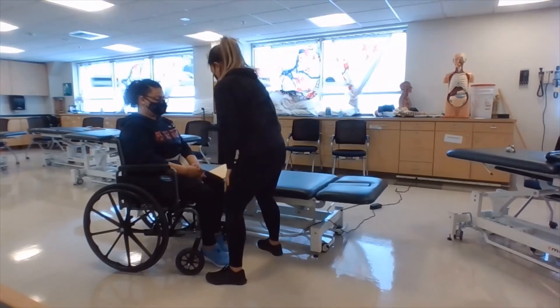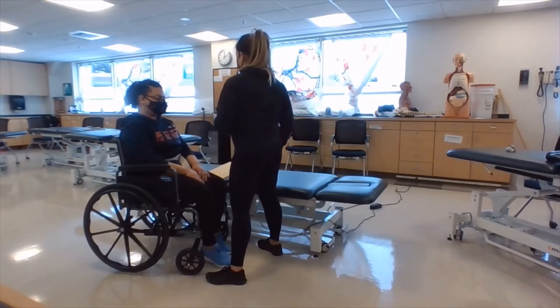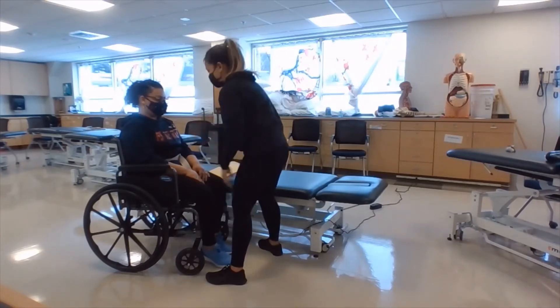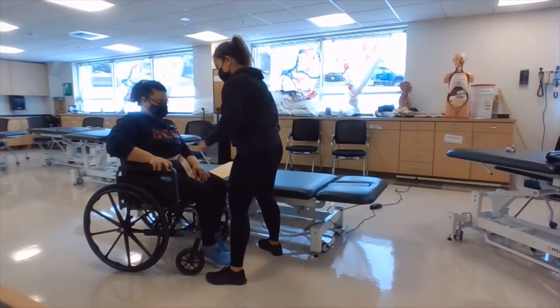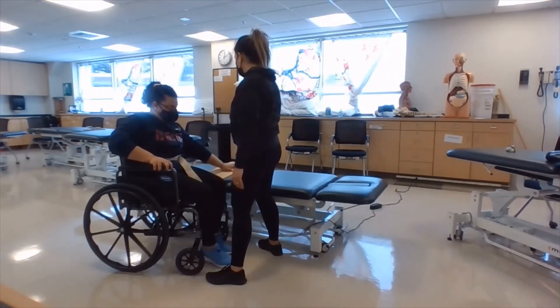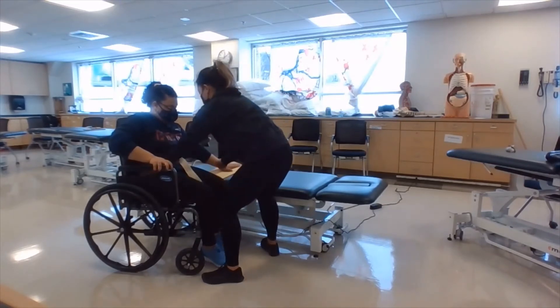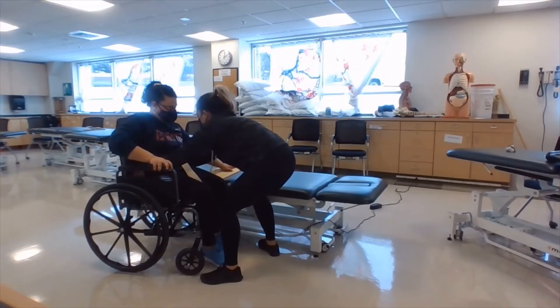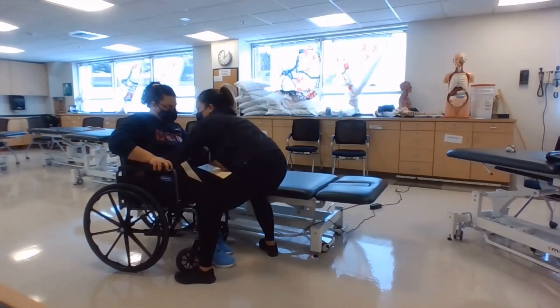The next thing you want to make sure of is having a wide base of support while you do this transfer. I'm going to break it down into two parts. The first part is having the patient rest her hand on the armrest and the other one on the flat side of the board, making sure that her fingers are not tucked under the board. Then I'm going to position my hands — either on a gait belt or right on her hips — with a nice wide base of support. I'm going to have her lean her head away from the bed while I guide her hips onto the board.